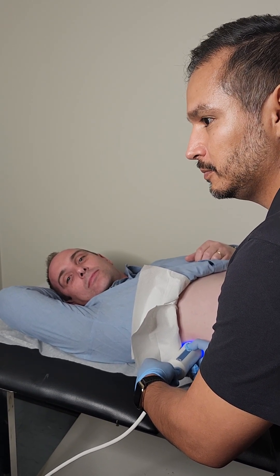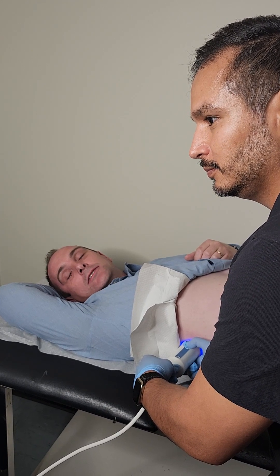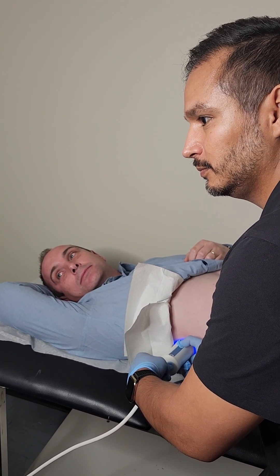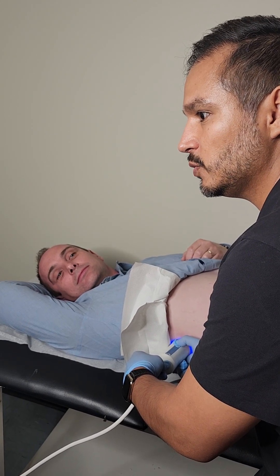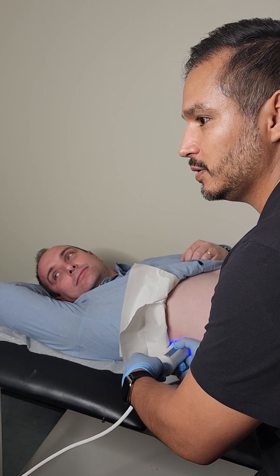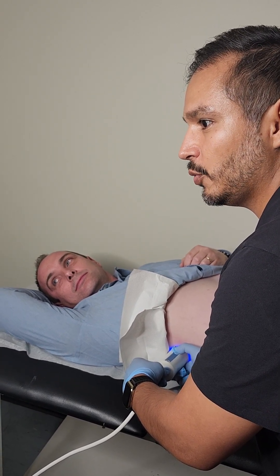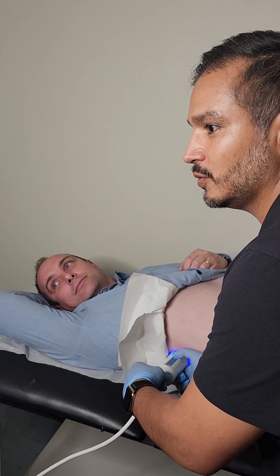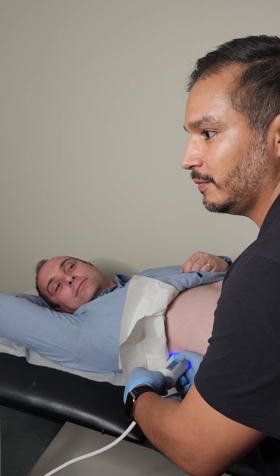And Brad, how's that feeling down there? I'm just laying here. Does it hurt? Not at all. No, you don't feel anything really. About how long does this take? This takes about 20 minutes or less — it varies depending on the person and the anatomy. But we schedule the appointment for an hour because patients have questions and we're here to answer them and address any comments or concerns they might have.